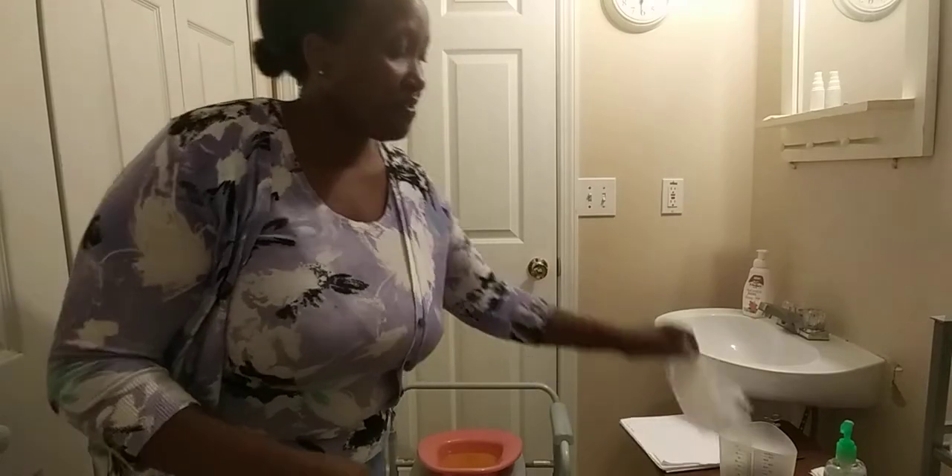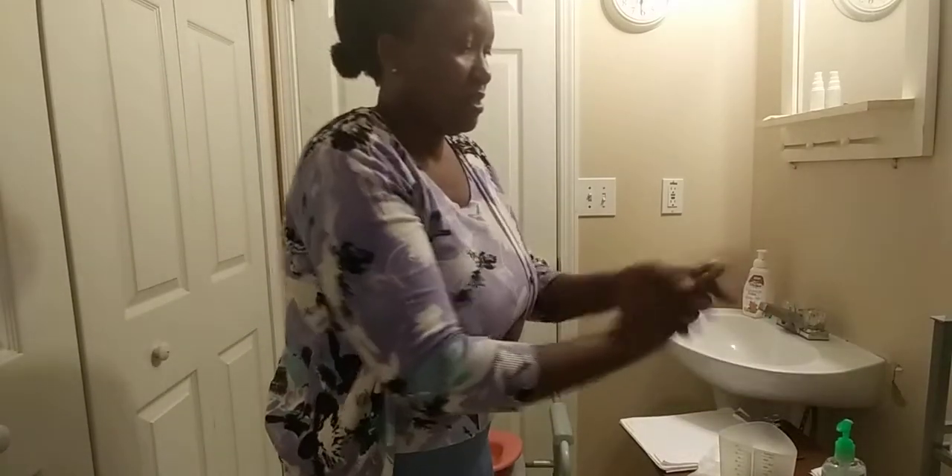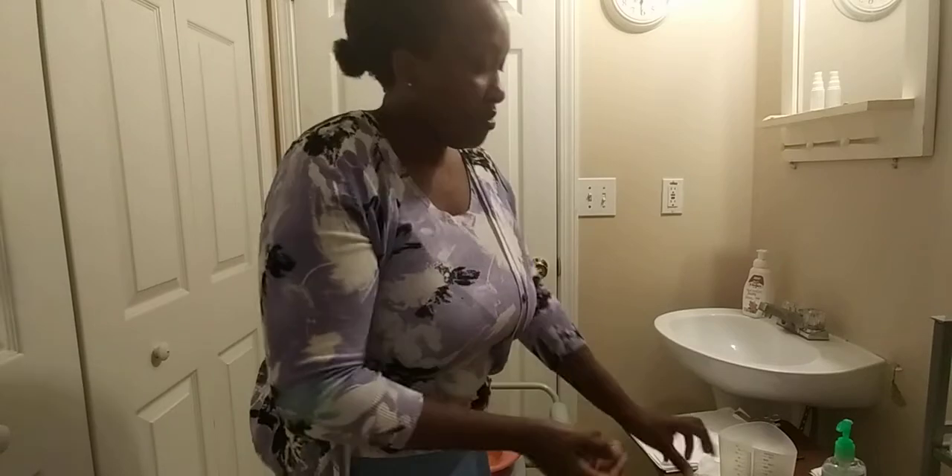Before you handle the urine, you want to make sure you put on a pair of gloves. I'm going to wash my hands with an alcohol paste and put on my gloves.